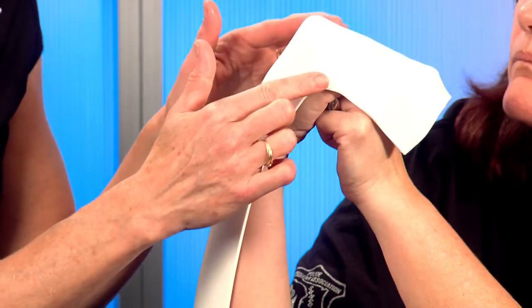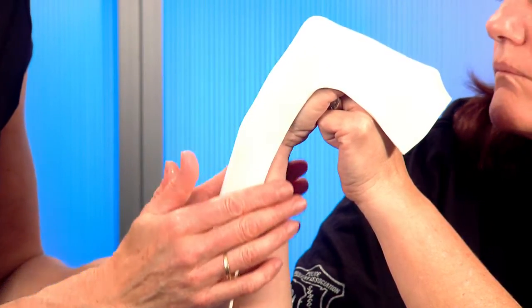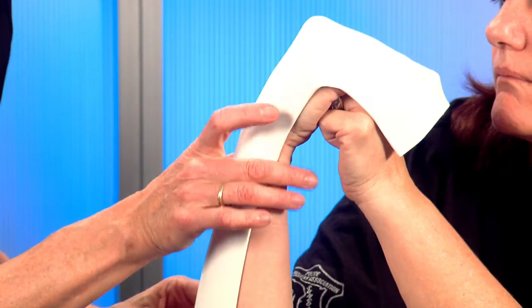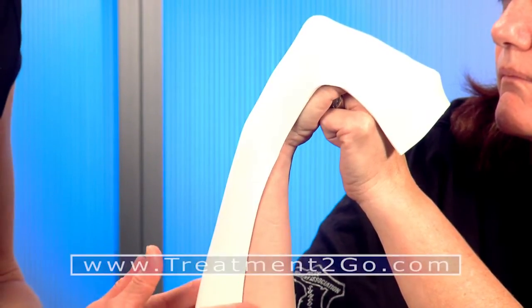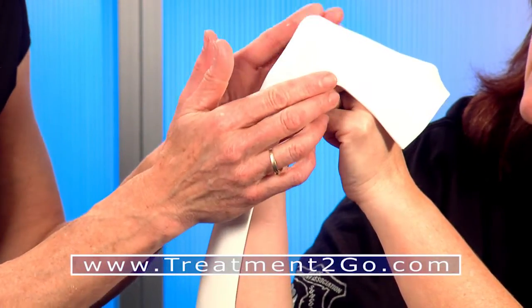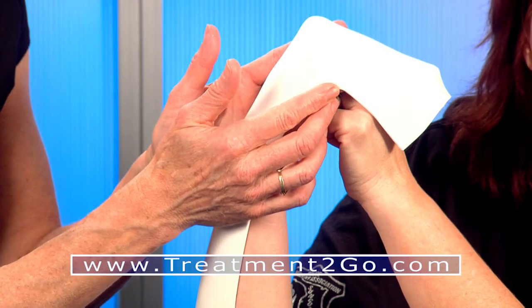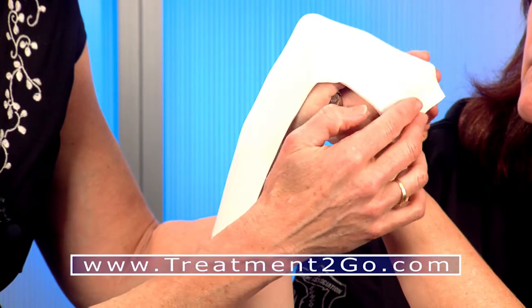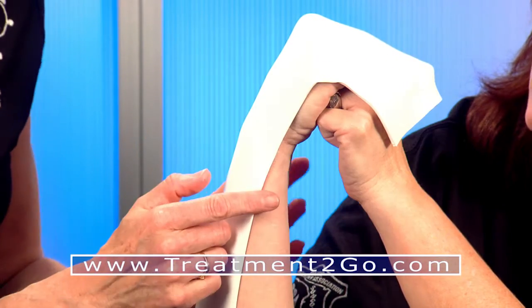You can actually see all the joints as it drapes around them. What's nice about this material is it will become hard and rigid. It's very soft as it goes on, but it totally conforms to my bent MCP joints and the straightness of my fingers. I can catch it on the ends of my fingertips so I know exactly where I need to trim.